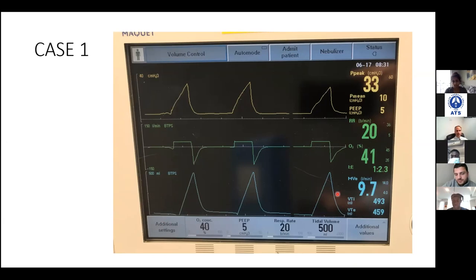Now here's output. These are output values over here. So the actual respiratory rate, the peak pressure is up here. This is the minute volume. And then we have our waveforms, okay? Three waveforms: you've got pressure, flow, volume, okay? If your ventilator only shows you two of these, which one do you throw out?